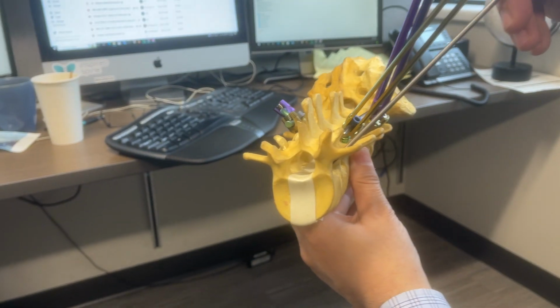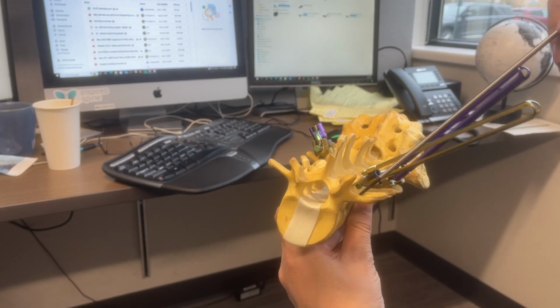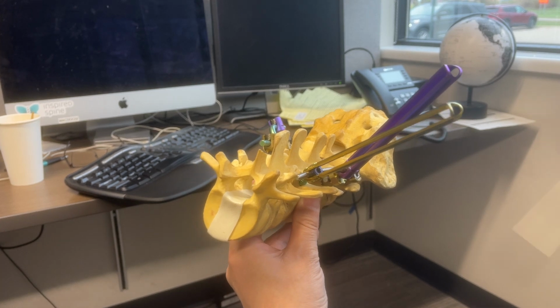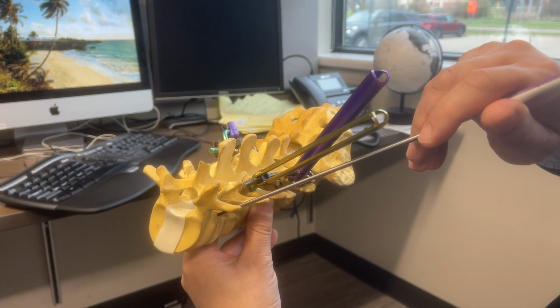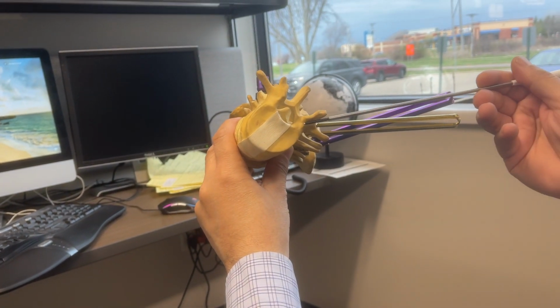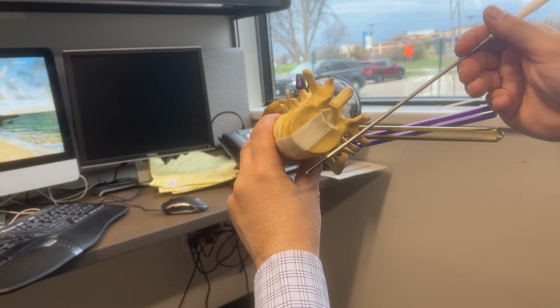The problem with the rotation is that, imagine I go from the left side, if there's vertebral body rotation, more and more and more, all of a sudden the angle that you have to take is almost horizontal, more tissue because the body is right here. And if you're not careful, instead of going through the Trans Kambin approach, you slide in and you're in places you don't want to be.